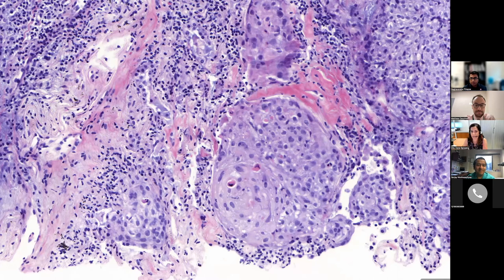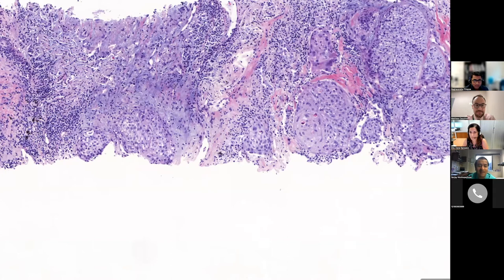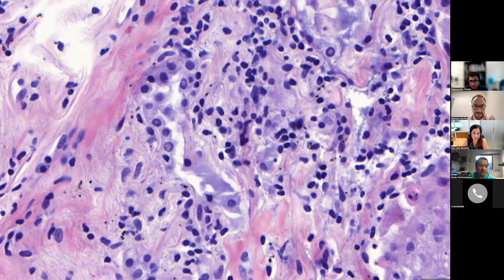Can you show it, Irene, a little bit higher mag, and that will be really good for residents to see what that looks like. At high mag, the entrapped epithelium, yeah, like this. That's a great point. I also feel that not just residents, pathologists also get misled by this, that this is glandular. We say residents, but many people can confuse this, even lung pathologists in some settings.